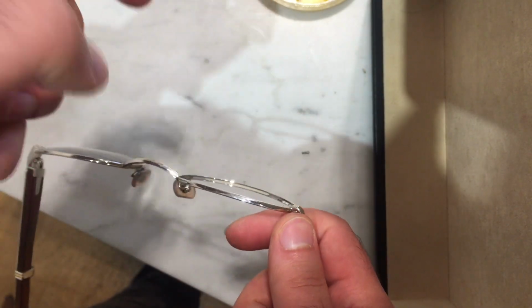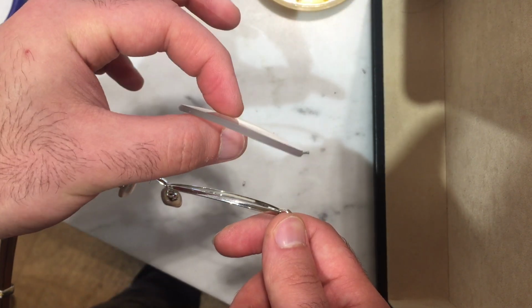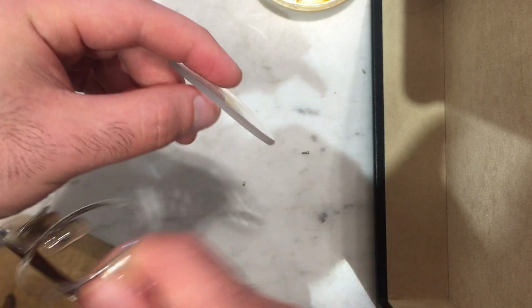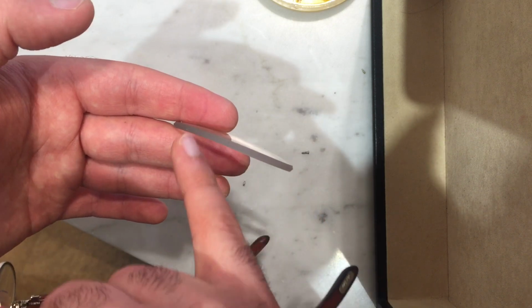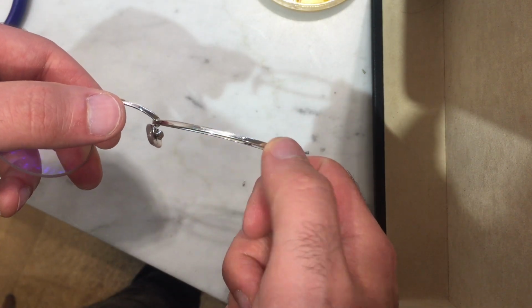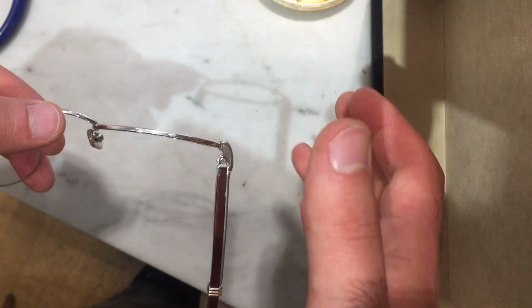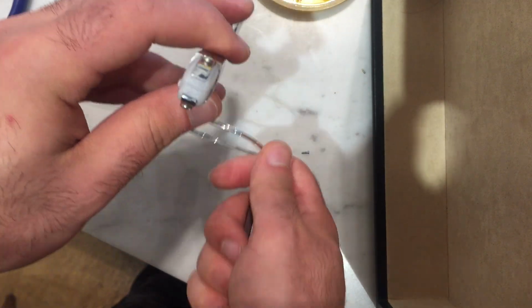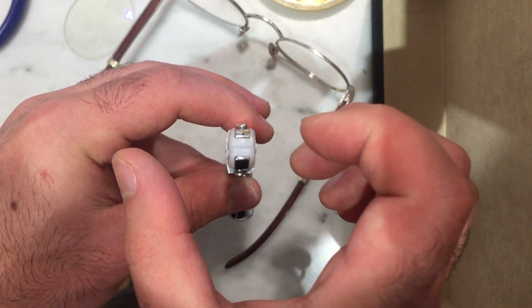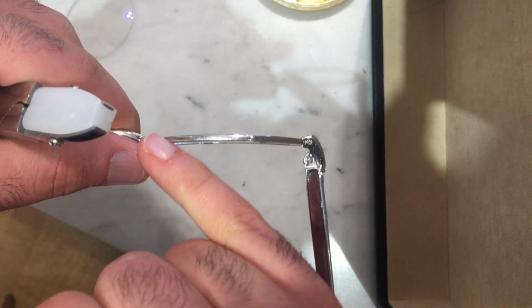Another thing to keep in mind is oftentimes for plus lens, like is visibly the case here, you often find, and this happens actually with minus lenses too, where your lens has a curvature, so your lens is curved, whereas the frame front is too flat for it. So what ends up happening is that the lens sticks out from the front. And again, there is a proper tool for that. It's like a set of pliers, like this, but instead of this thin mouth, it actually has a wider mouth that has a curve on it, and it basically presses in on that curve, which is where you put this part of the frame to give it more of a curve.